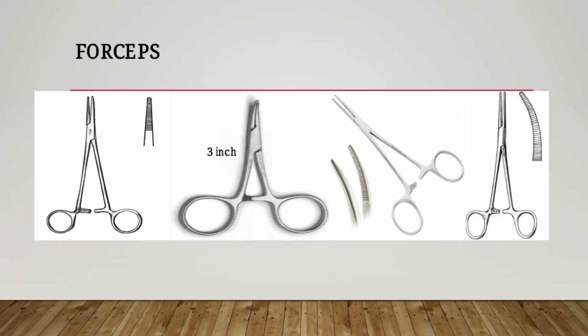Forceps. This is an important instrument which is used in surgical processes, that is forceps. There are various types of forceps used to hold the tissues or pick up the swabs, etc. Number one is the artery or hemostat forceps, which are used to block the bleeding or to ligate the arteries or the blood vessels.